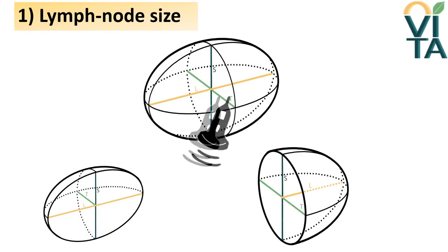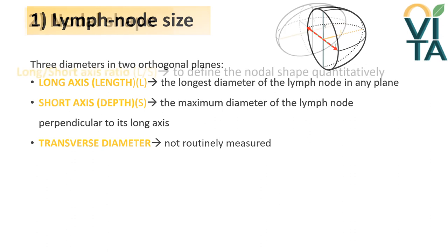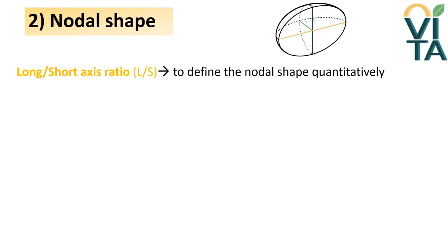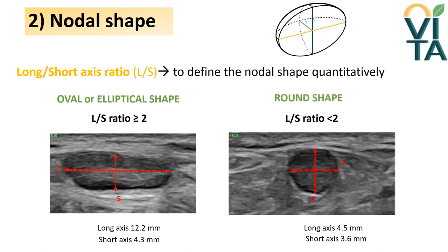Rotating the probe 90 degrees clockwise, the transverse plane of the lymph node is obtained. Here the transverse diameter can be seen, but it is not routinely measured. The nodal shape can be defined from a quantitative point of view using the long-short axis ratio, also called the length-depth ratio. Traditionally, an oval or elliptical shape corresponds to a long axis at least two times greater than the short diameter, while round lymph nodes have an L/S ratio less than 2.